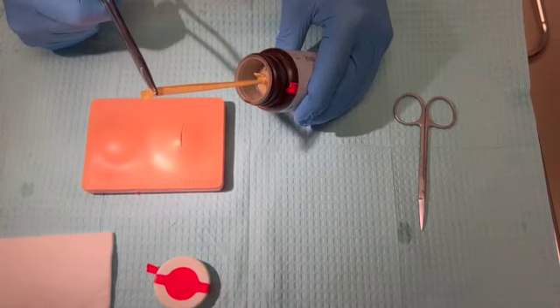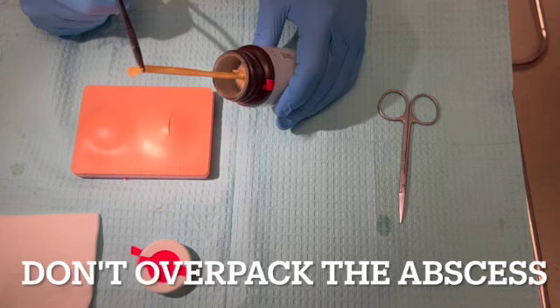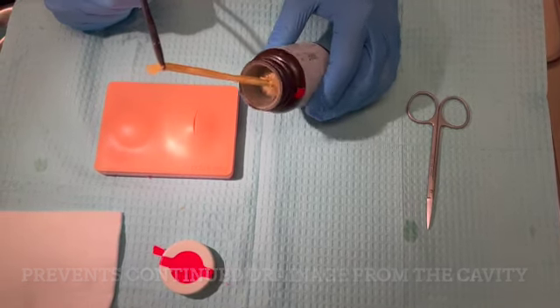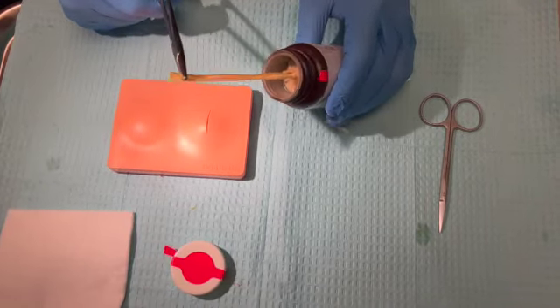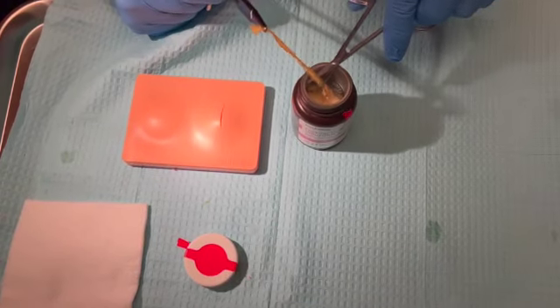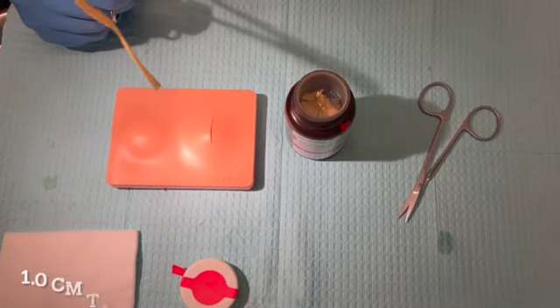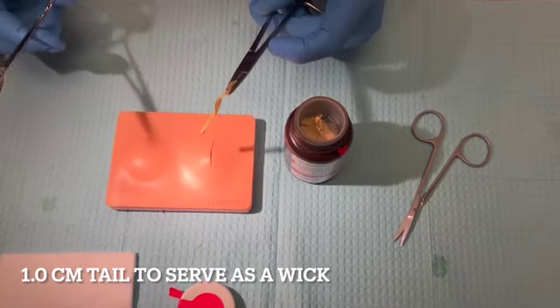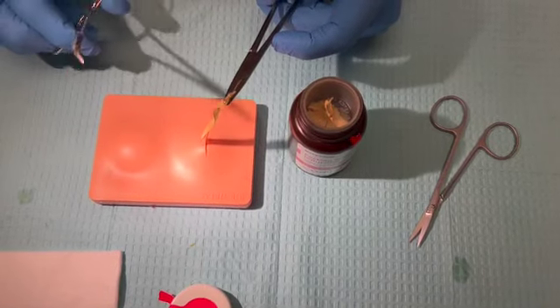As we pull this out from the bottle, we identify that we don't want to overly pack the abscess. If we pack the abscess too tightly, it can prevent continued drainage and can result in tissue necrosis from excessive pressure within that cavity. The ultimate point of packing is to keep our wound open. We'll cut this out. We're going to want to leave a total of approximately 1 centimeter of packing outside of the tissue as a wick to allow for continued drainage and something that we can grasp when the patient returns.